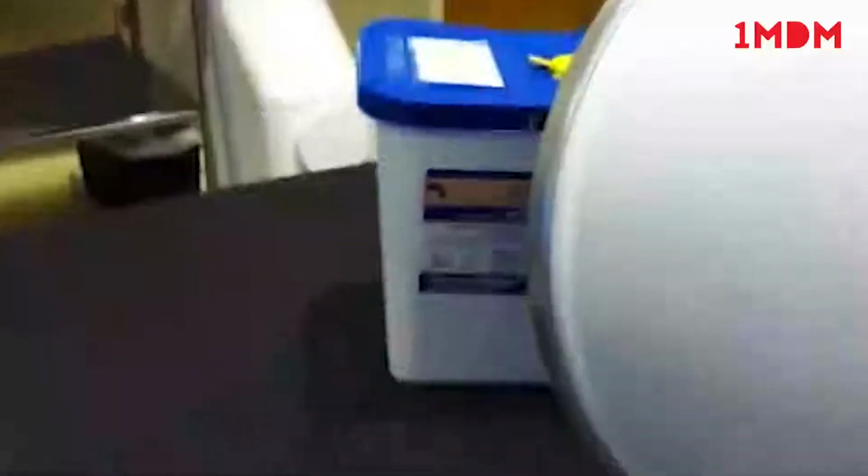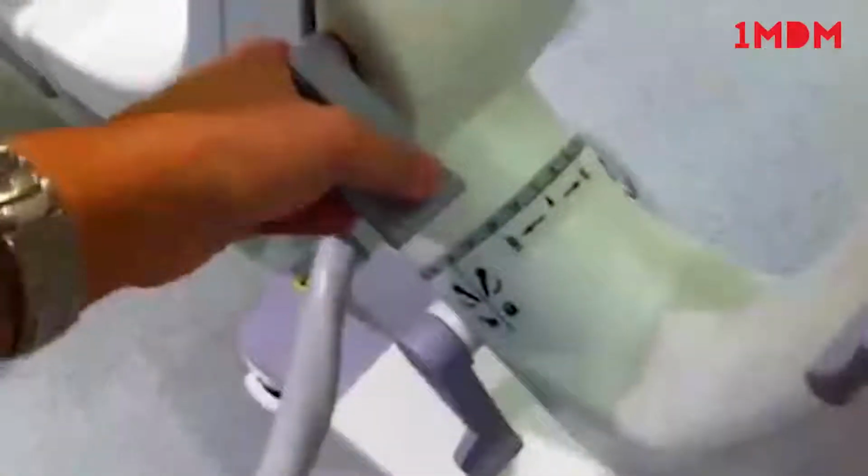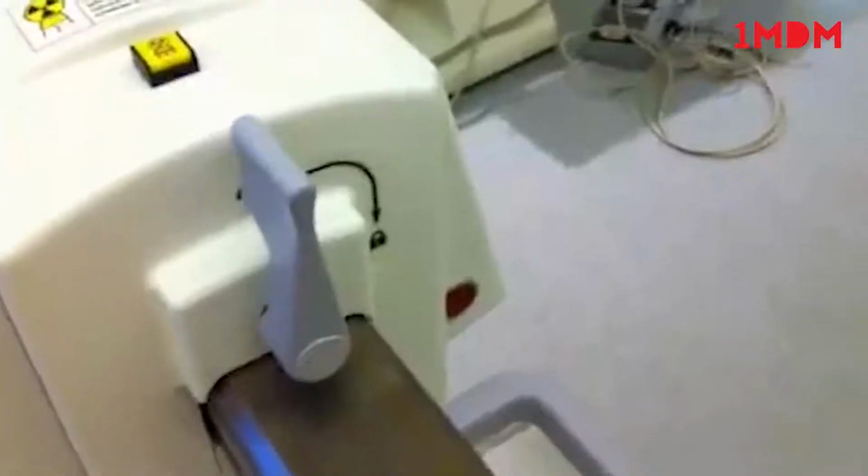Collision. So that's why I take this lock and this lock off, because I want to be able to swing the machine and pull it back as necessary. This way I can also do my centering ahead of time. Put it back at 0, lock it, lock this one too, and we're back to AP.